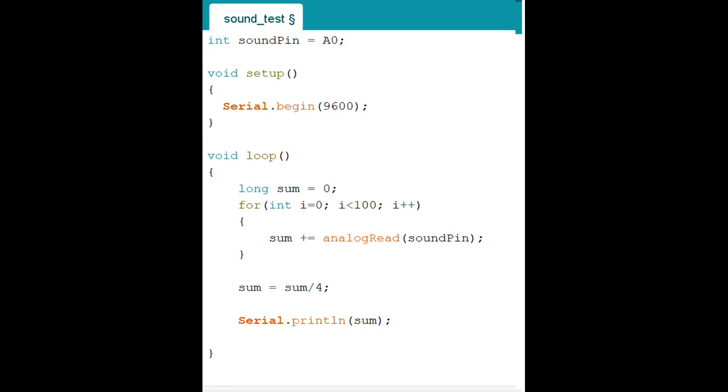So sum plus equals, like I'm assigning, right? analogRead. Analog is a small letter, R is a capital letter, then read. That's a special language for Arduino. Analog, you're reading the analog input. Read, you're reading it, right? And then what you're reading is sound pin. Sound pin, it sounds familiar. We assigned the sound pin in the first line, which is A0. So what this is telling the computer is, hey, sum is reading the input from A0.